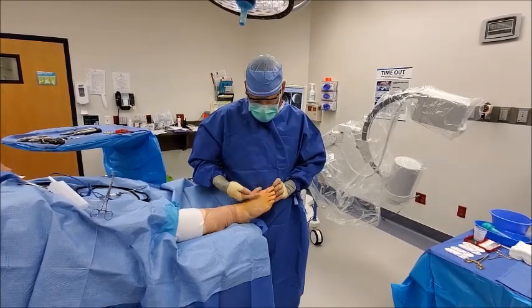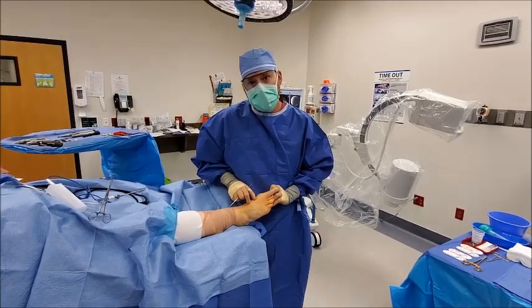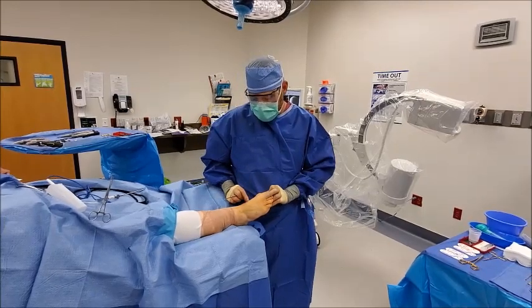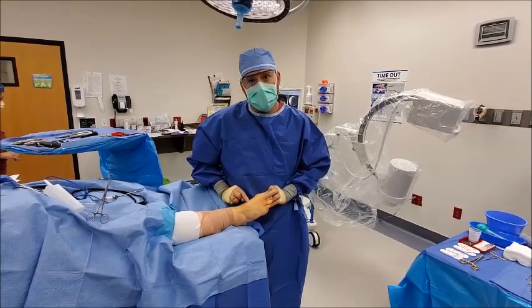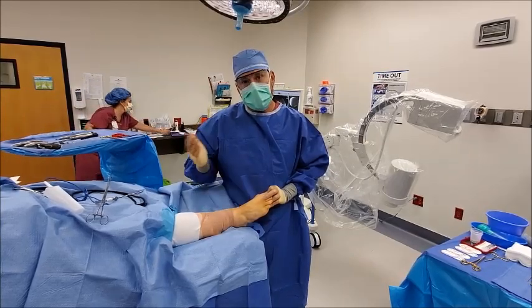We'll be reducing that angle through several incisions — a minimal incision, which is different from mini incision surgery that uses small incisions but does not correct the bunion from the source. The advantage of lapoplasty is it corrects it from the source, reducing the risk of recurrence from up to 70% down to 1 to 3%.